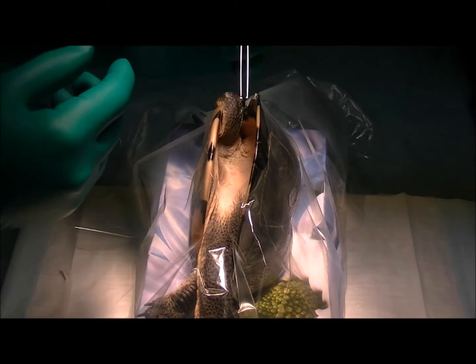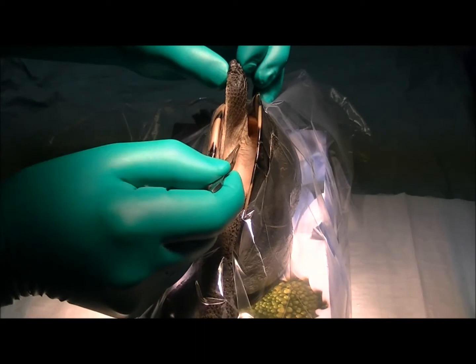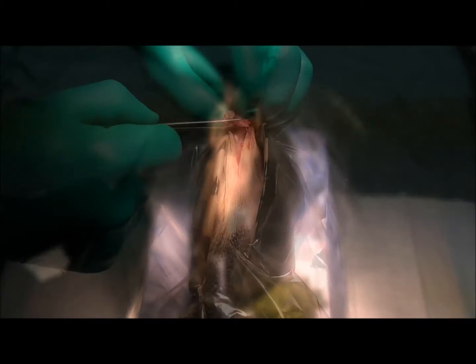We've got her anaesthetised and positioned — just to get you orientated in the video here. This is her front right leg here going down into the shell, and her head and neck goes down over this way, hooked up to the anaesthetic machine. We're going to make an incision down in here to access that bone. It's going to be fiddly because it's deep and we'll have limited access, but hopefully we can get in there and place a pin.